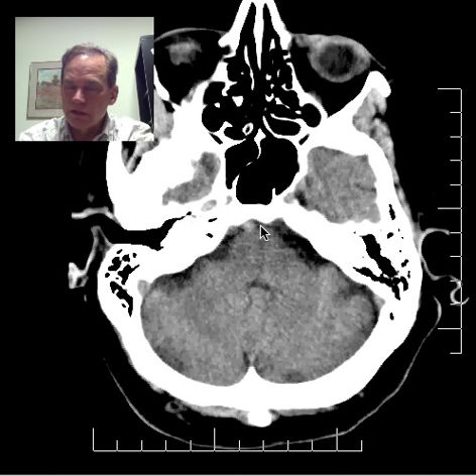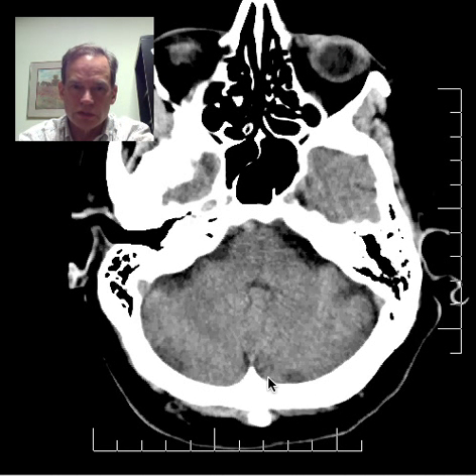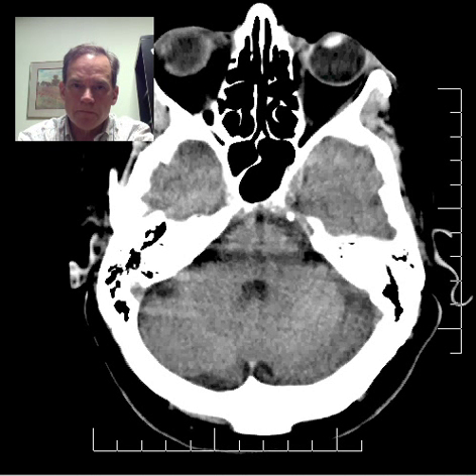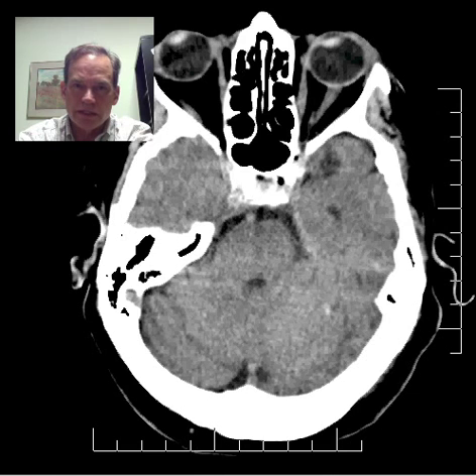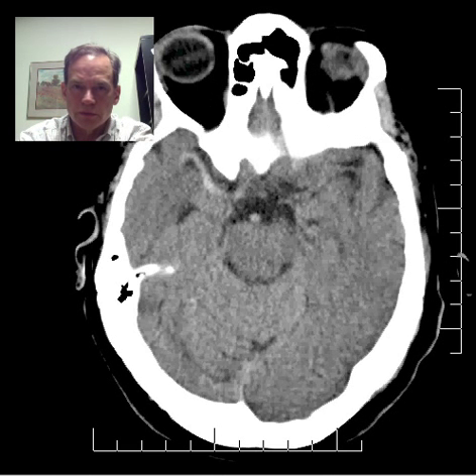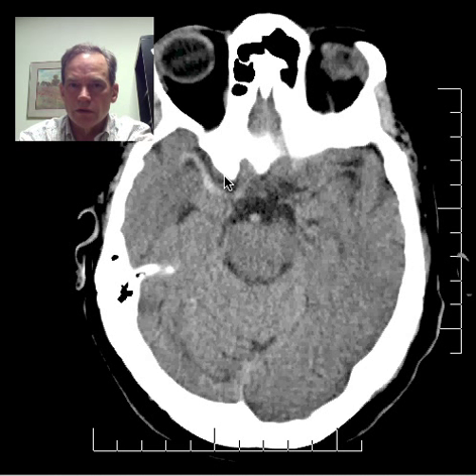The basilar artery often gets very tortuous, especially in patients with hypertension. That's the basilar artery — it looks pretty good.